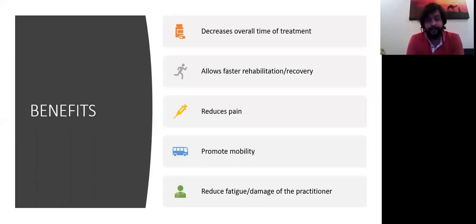Now, what are the benefits? Overall treatment time reduces. Obviously, I'm doing myofascial therapy and then I'm using an IASTM tool. I will get the inflammatory response earlier than with myofascial therapy alone. Faster recovery or rehabilitation, reduces pain, promotes mobility.